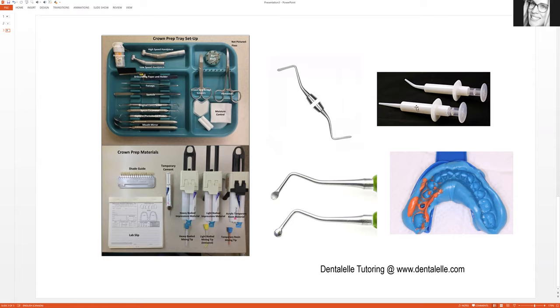I forgot to mention something that happens at the very start of the appointment — you will likely be taking alginate impressions of the top and bottom teeth. This is done so the lab can see how the teeth looked before the crown prep and how the upper and lower teeth fit together. You will also want to take a bite registration of the area where that crown will be.